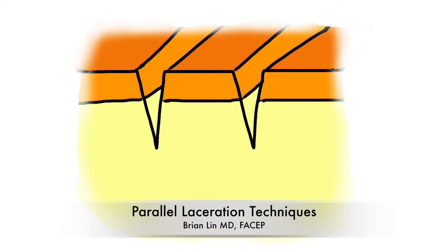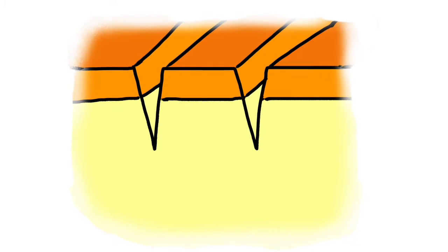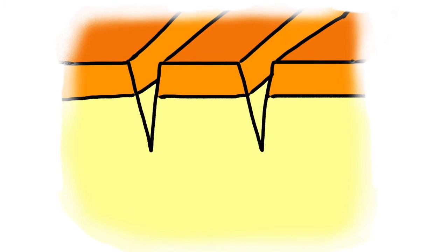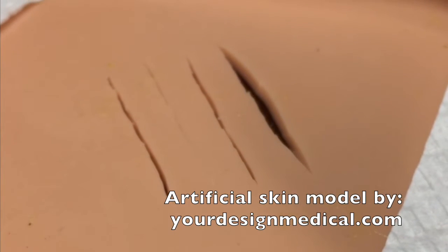This video describes some techniques which can be used for the closure of multiple parallel lacerations. This is overall an uncommon situation but is sometimes seen in the emergency department setting. The artificial skin used in these videos is designed by yourdesignmedical.com.